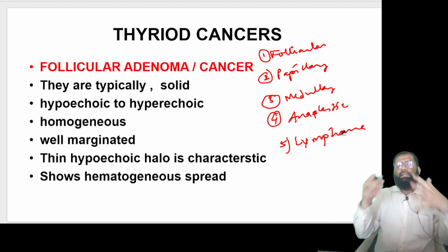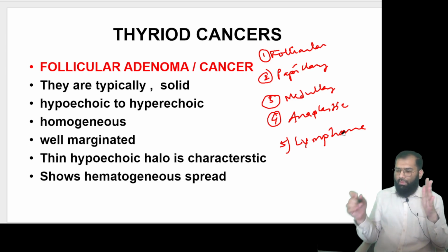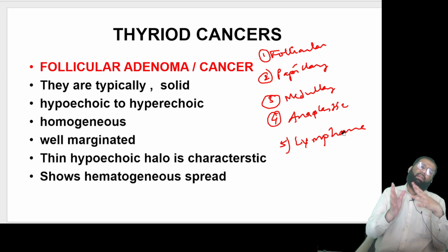Okay, so in my subsequent session, you will be seeing these various malignancies, that is follicular, papillary, medullary, anaplastic, and lymphoma.